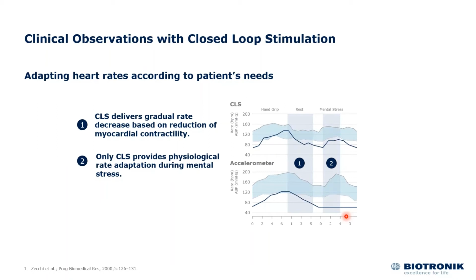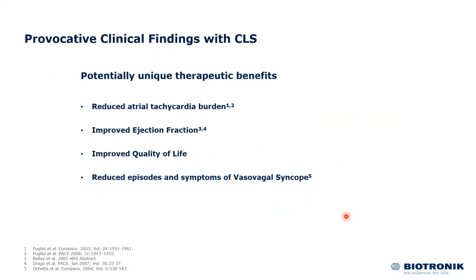So you may end up with a patient who had an implant of a pacemaker with open loop stimulation. They may end up suffering from inadequate cardiac output, because the pacing rate doesn't increase based on their physiological need. Whereas the CLS pacemaker-implanted patients tend to have more near-physiological responses in terms of pacing rate increment based on the physiological responses and need.